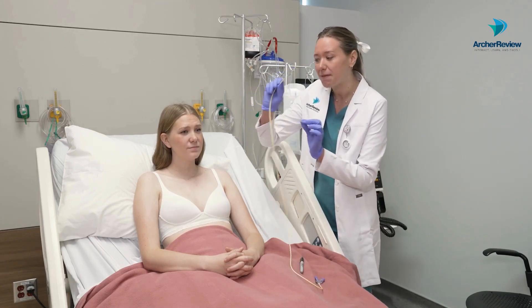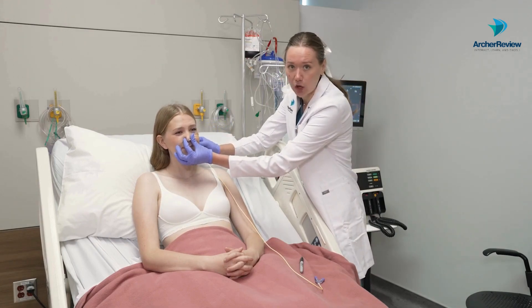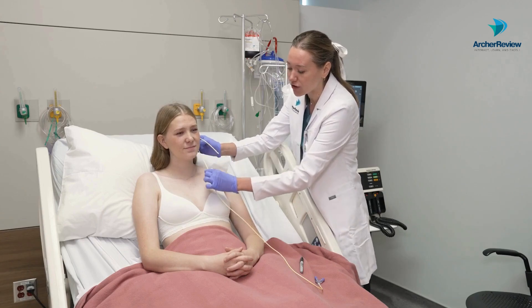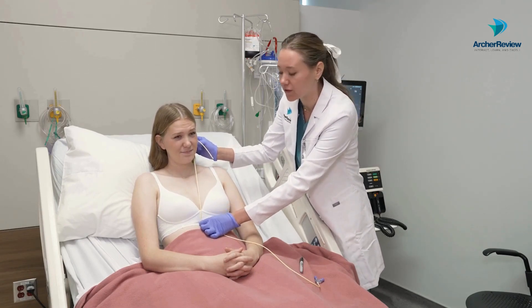On your client, you're going to take the tip of the NG tube, start at the tip of their nose, and go to their earlobe. From the earlobe, you then measure down towards the xiphoid process, which is that bottom bone of the sternum.